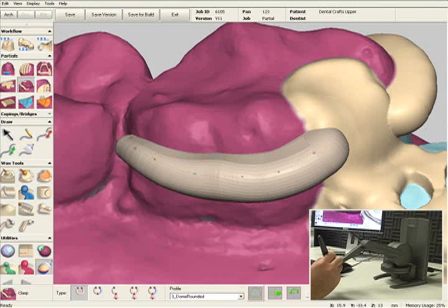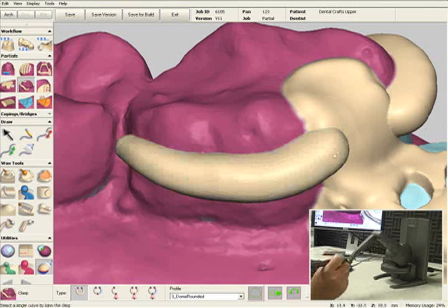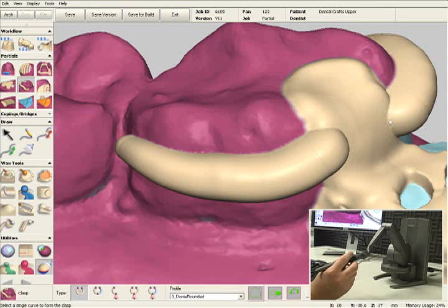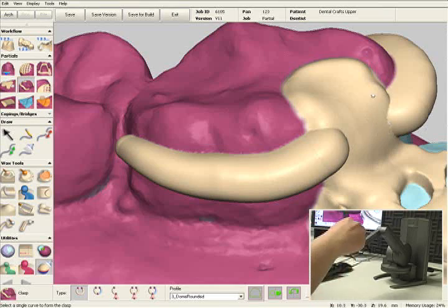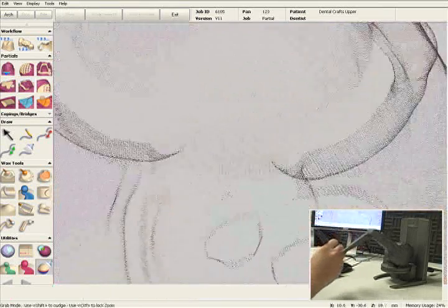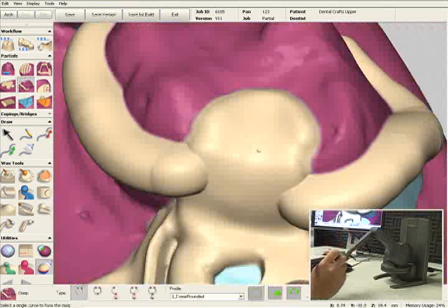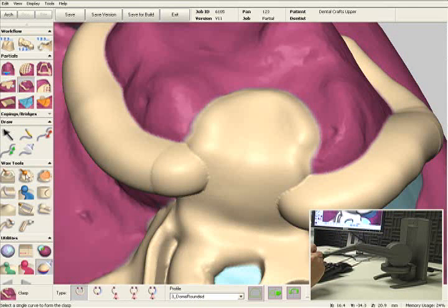Now there's also a guide plane right here on the molar that I'd like to make a little bit thicker, so it's nice and even with the Akers clasp that I have on this molar. I'm going to select the tool called the smudge tool.